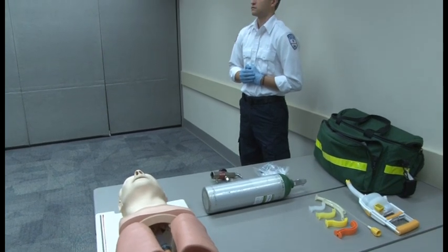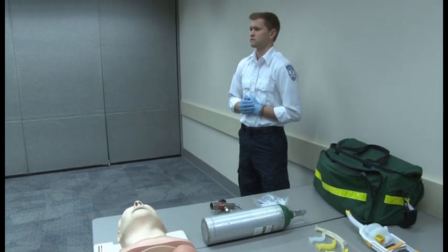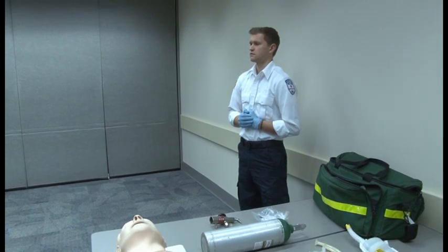I will serve as your trained assistant and will be interacting with you throughout this skill. I will correctly carry out your orders upon your direction. Do you have any questions?